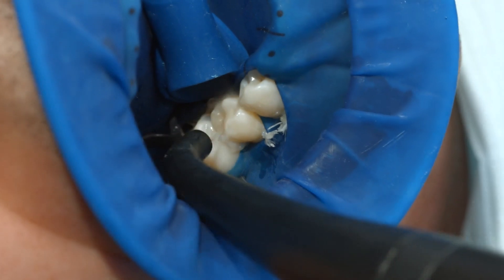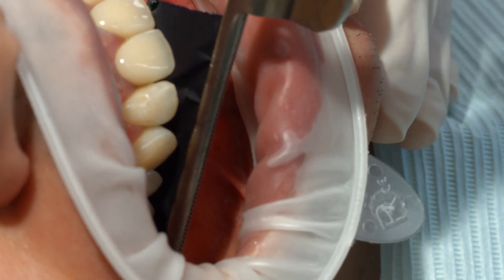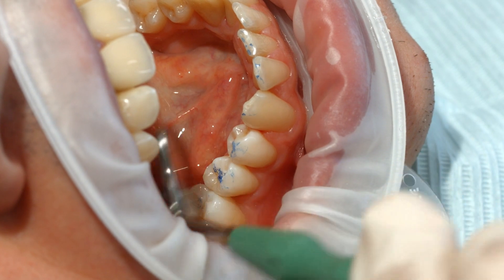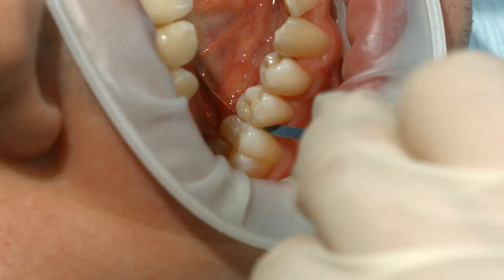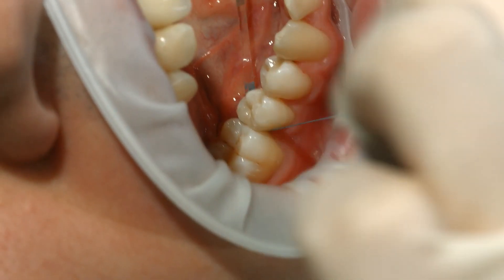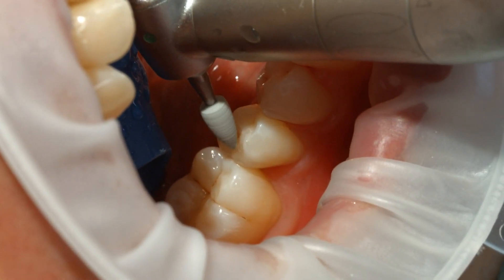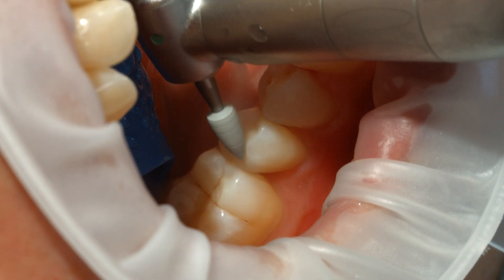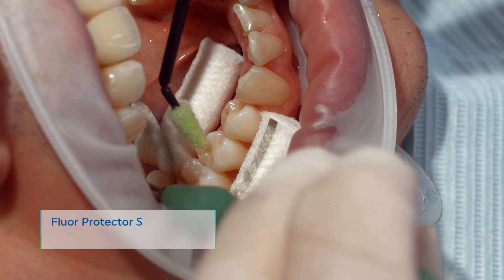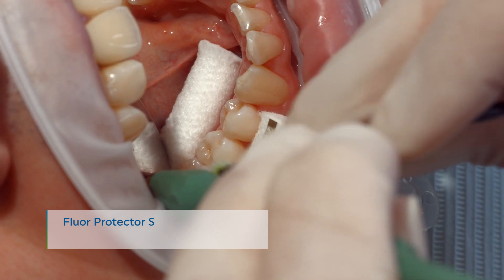Rinse off Liquid Strip. After having removed the rubber dam, check the occlusion and functional movements and make adjustments if necessary. Finish the proximal surfaces using finishing and polishing strips. Polish the restoration margins with polishers, such as Astropol, or with discs. As a final step, apply a thin layer of Fluor Protector S using a Vivabrush or a conventional brush.